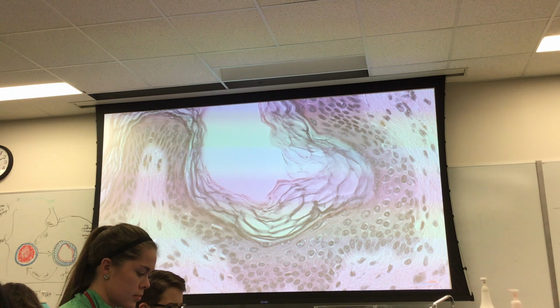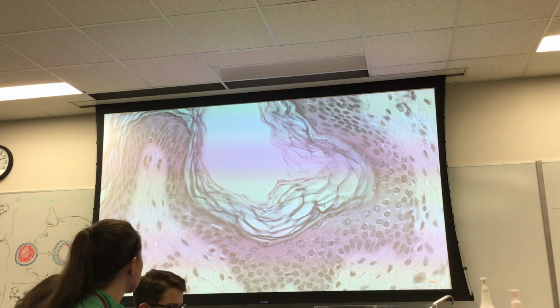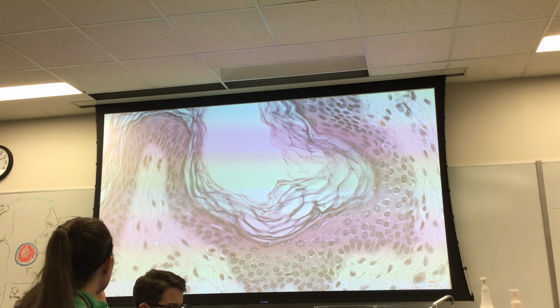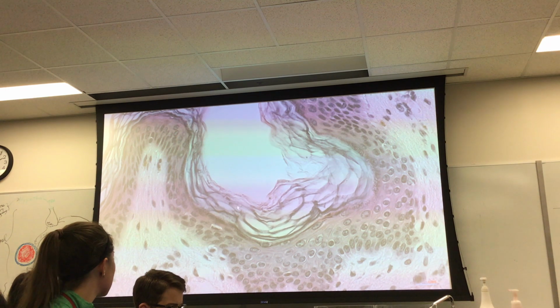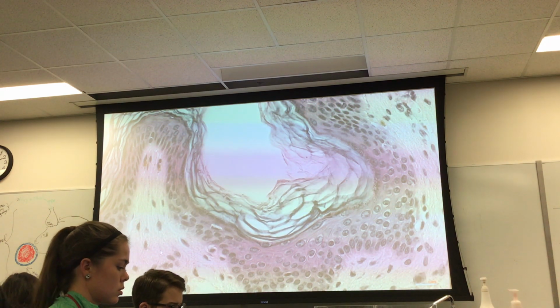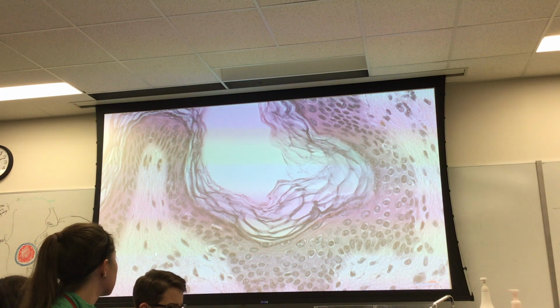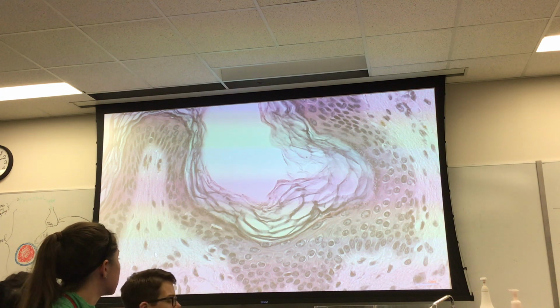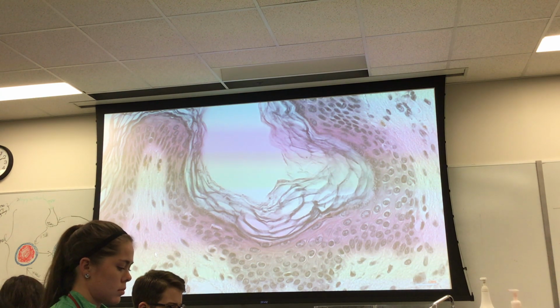All right, so if we've established that, the pointer is now in a layer best described as, so if this is the epidermis, what is this? Get it on top of the what? Dermis, good. But the dermis has two layers. Which one is this? Well, it's called the papillary layer. The reticular layer is the one that's got the denser collagen.